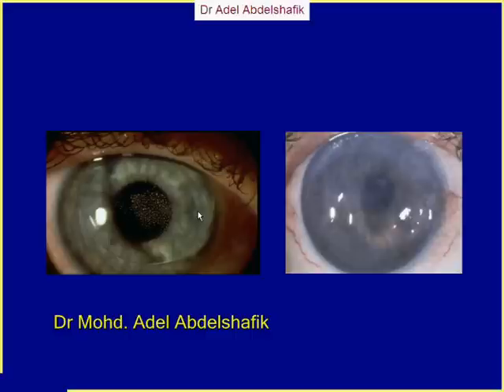In a slit lamp in general, if you use a higher magnification, the problems in observing things will be more difficult. Remember in pathology or in histology, when we were back at undergraduate, we used to identify the tissue we were examining by holding the slide and using the eyepiece of the microscope at a very low magnification to identify this is the liver, this is the kidney, or whatever. Then we go to higher magnification. The same applies here. We should always start the slit lamp with low magnification. If you suspect anything in one location, you can increase the magnification. But all the time we are using a low magnification.